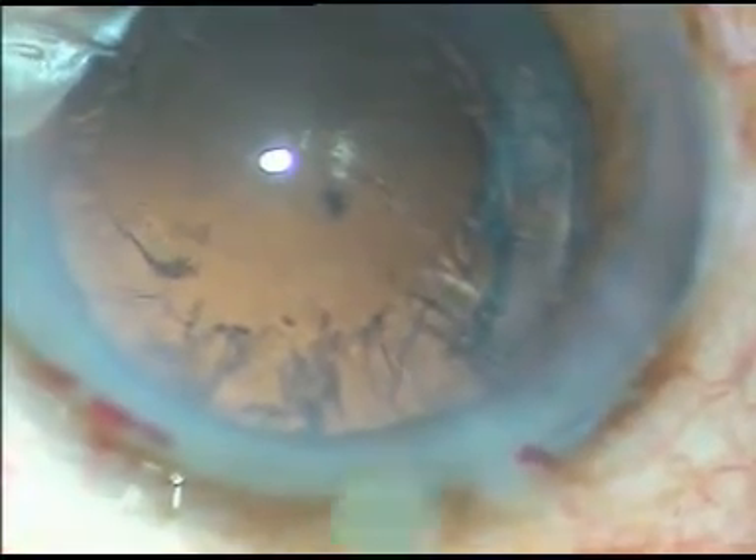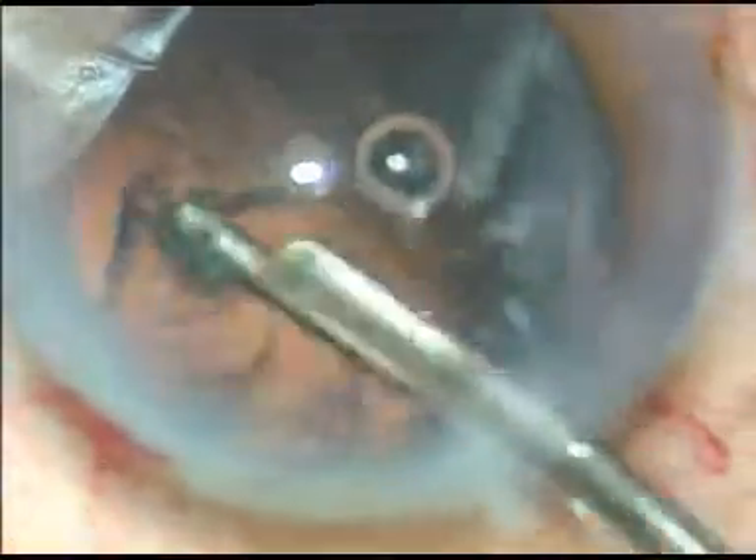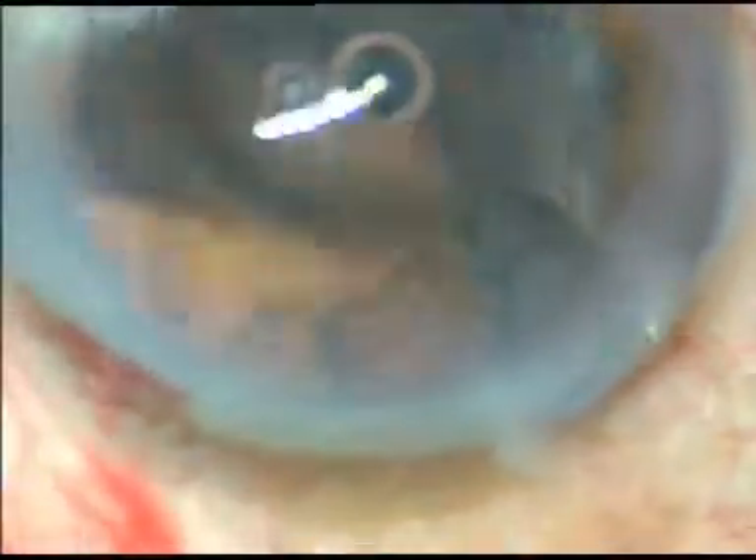Some viscoelastic is injected to protect the corneal endothelium, and I remove the cortex with the help of a direct Simcoe cannula. The cortical cleanup can be done with a bimanual irrigation aspiration system also, but I prefer this instrument. It works very well in my hand.